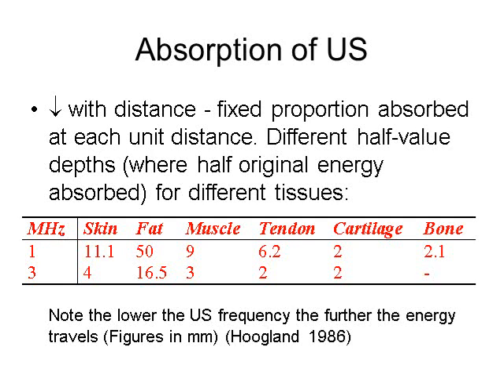Absorption of ultrasound by the tissues is how it will have physiological effects, including heating. Absorption decreases with distance, with a fixed proportion being absorbed at each unit distance. Commonly, the half-value depth is used to describe the depth of penetration. This is where half of the energy applied at the surface remains within the tissues. These figures are useful in determining whether you are likely to be able to target the affected tissue and which treatment frequency head to use.